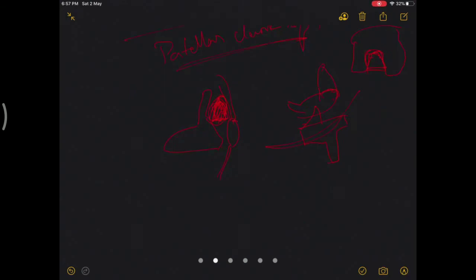As it goes on, there is fibrosis of this nodule, and it will get stuck at the notch, and you literally have to put in effort to take that nodule out of the notch. This is a typical complication of posterior stabilized knees, because CRs don't have a bigger notch like the posterior stabilized. You can get away from this by taking out more of the fat pad.